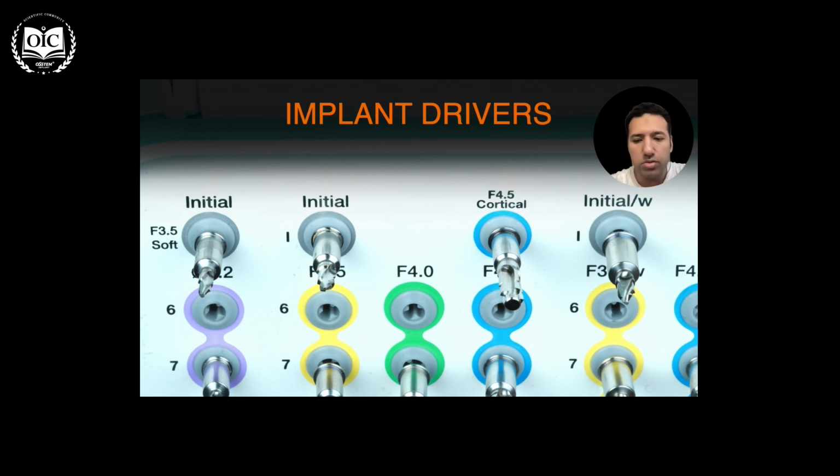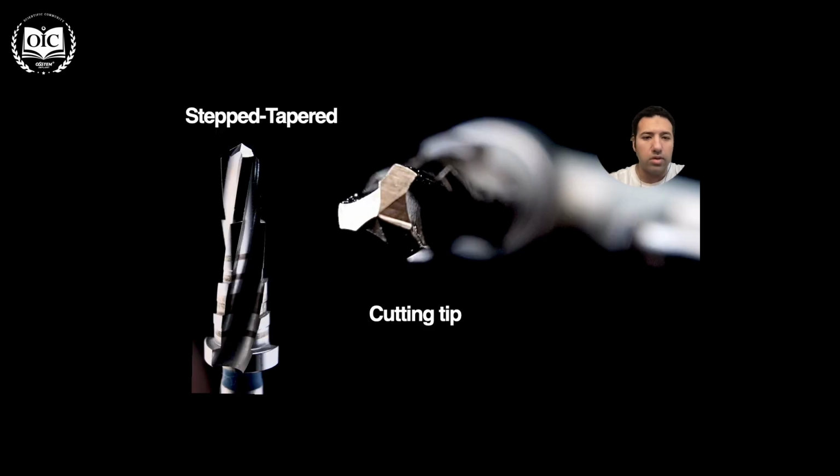And let's also take into consideration the size of the implant. We have 2 sizes of the barrel in the OneGuide Kit. We have the 5 millimeter standard diameter of the barrel of the guided drill, and we have the 5.8 wide diameter for the 5 millimeter implant. When we do drilling for the 5 millimeter implant, we need a wider drill to accommodate the size of the drill, and also be in a bigger contact with the guide while doing this drilling protocol.